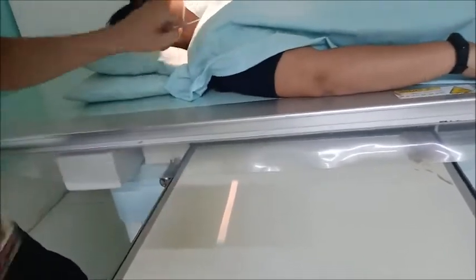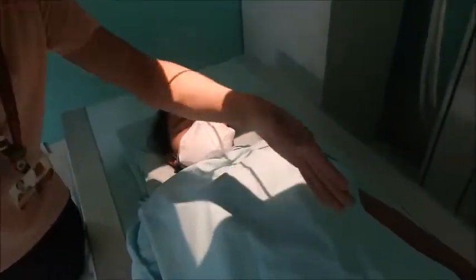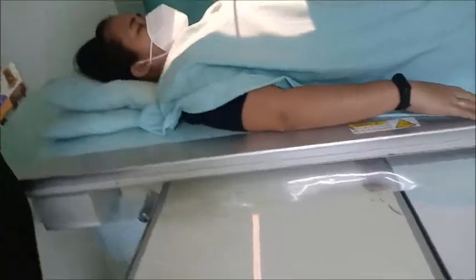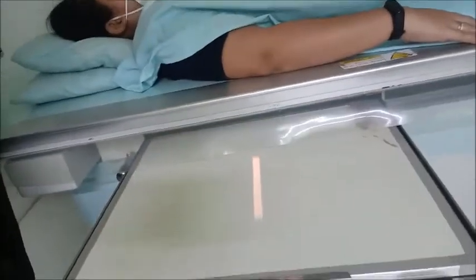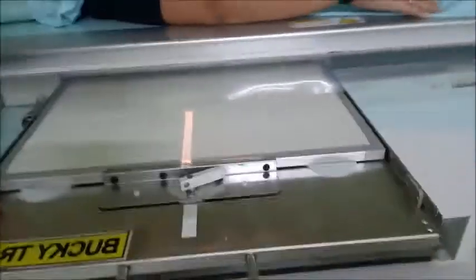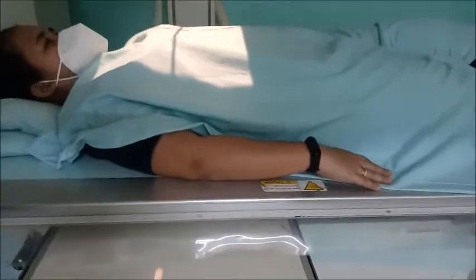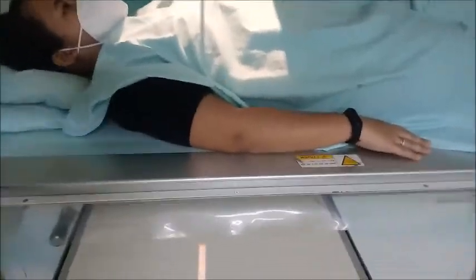Na ato i-move si patient padalong dito so that the top is also at the level of C7. Siya, top niya C7. Tapos the vertical niya is at the MSP of the patient. Then move. So that the center wait siya doon collimator na sa tanong na.